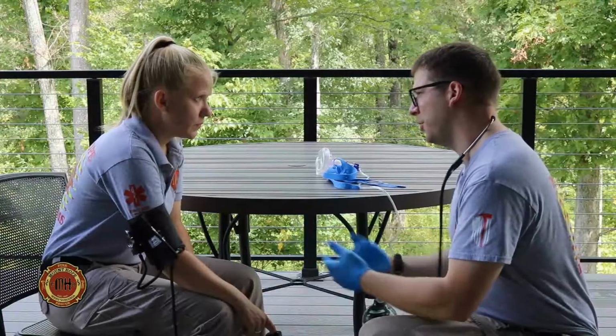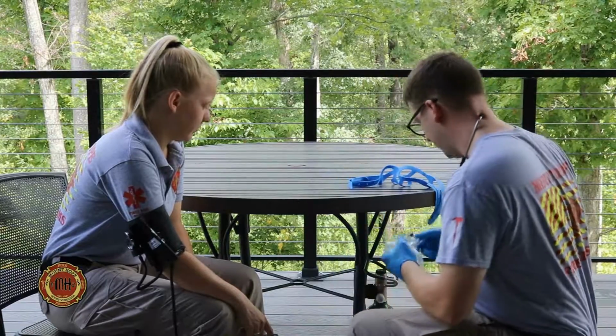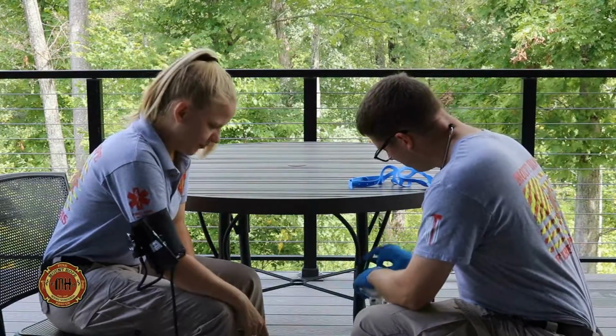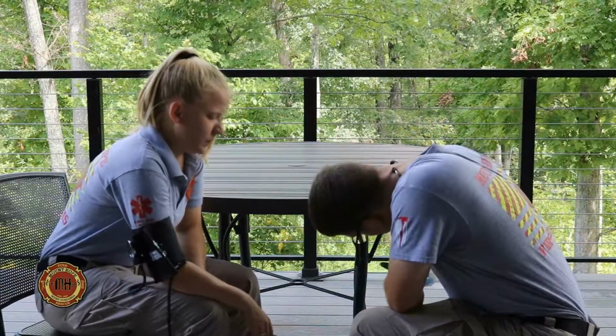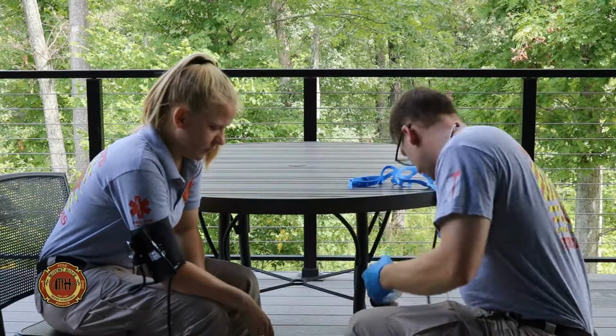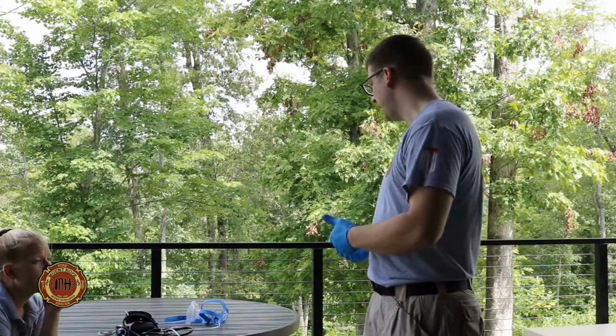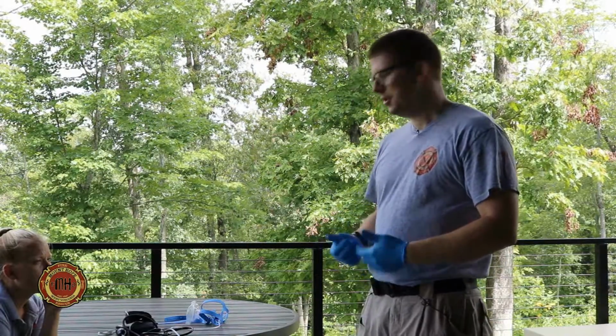to your patient what you would like to do. Tell them that you have a device that's going to help them with their breathing, it's going to blow air onto their face, and it's going to make them feel better. After that, you want to set up your device, turn your device on, and check your oxygen level.